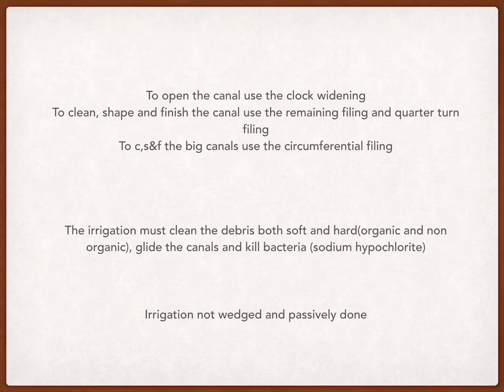And it should lubricate the canals and kill bacteria, and all of these things, except for the removal of the non-organic hard tissues, are done by sodium hypochlorite, so sodium hypochlorite is the best irrigant that you may use in association with EDTA, which will remove the non-organic hard debris.